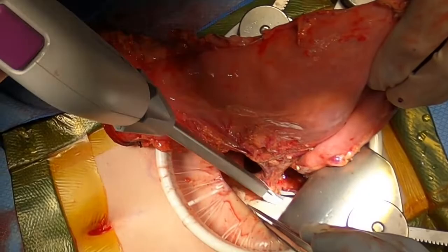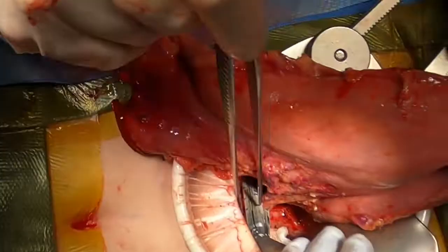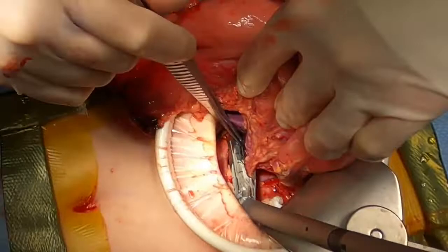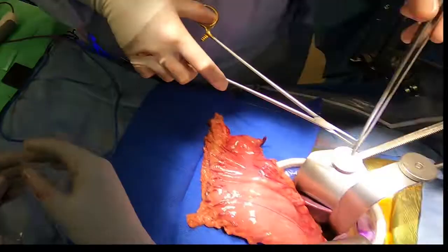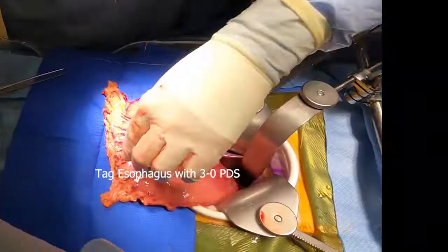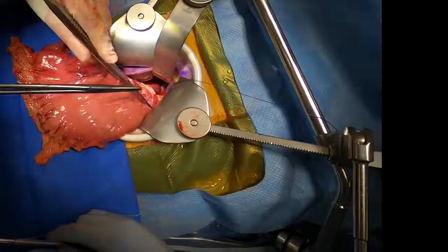The left gastric pedicle is then divided using a stapler with a vascular load. At this point, we are ready for the division of the distal esophagus.